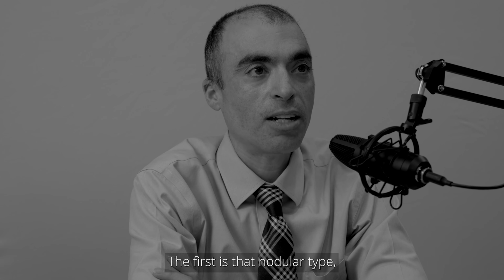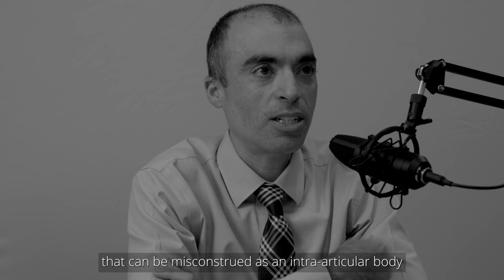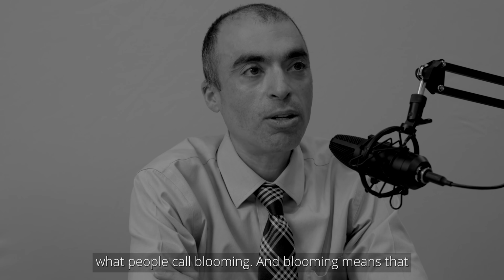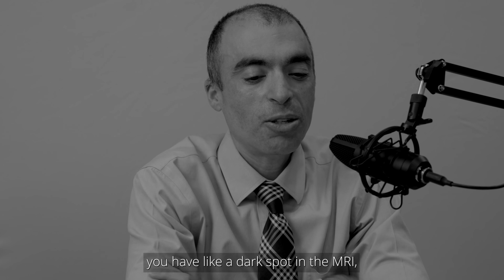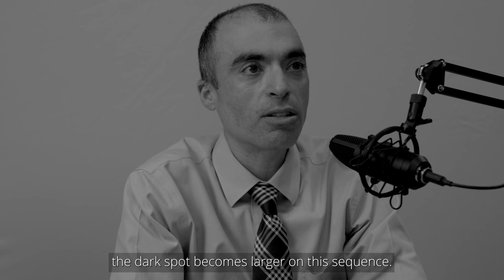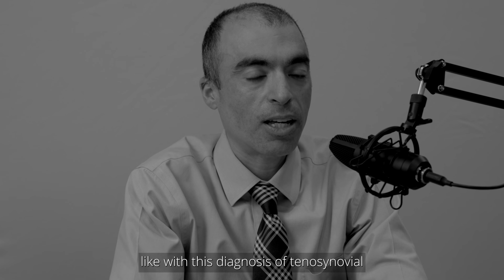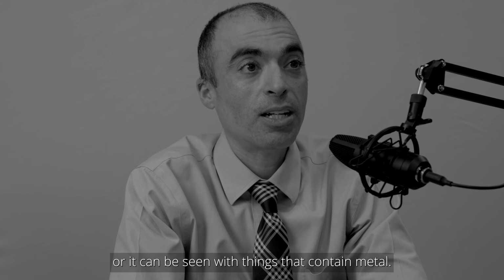The first is the nodular type, the type that I'm saying can be misconstrued as an intra-articular body just from arthritis, and what people call blooming. Blooming means that you have a dark spot on the MRI, and the dark spot becomes larger on this sequence. That can be a finding that you see in hemorrhage, like with this diagnosis of tenosynovial giant cell tumor, or it can be seen with things that contain metal.